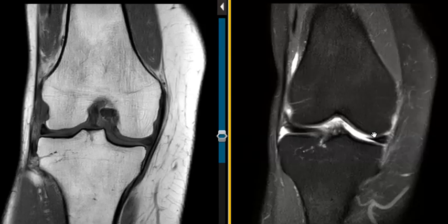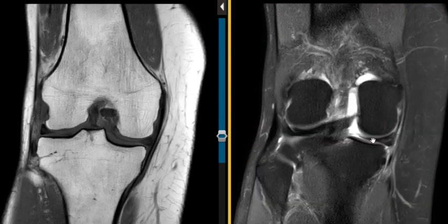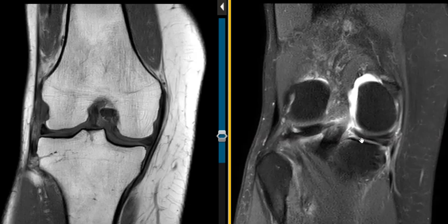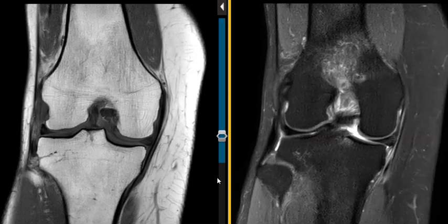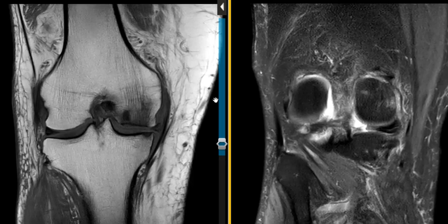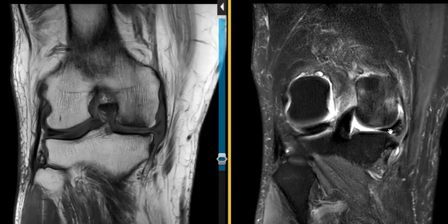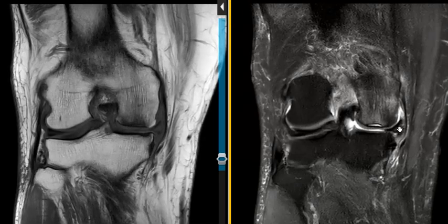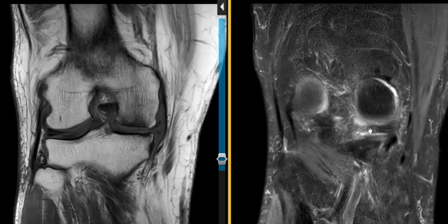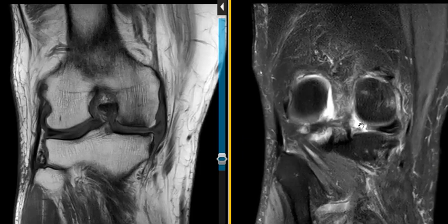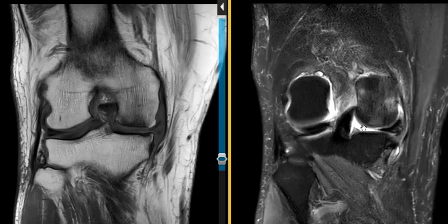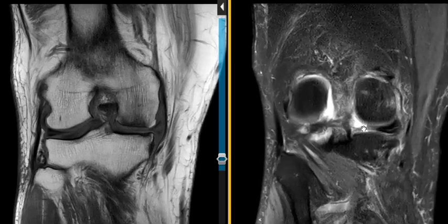The next patient I read has a very similar finding — a tear of the meniscus root. Now this is a 68-year-old male, and he has, again, a very similar finding. This is his posterior horn, and the meniscus root is right here. We see that fluid going into the meniscus root tear.